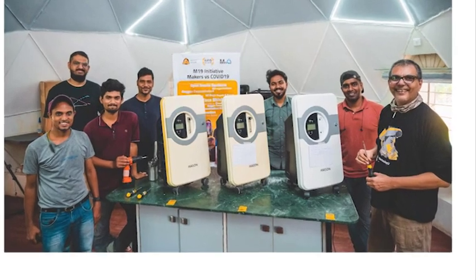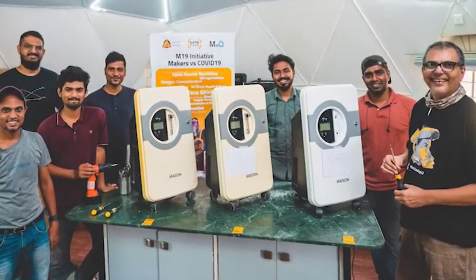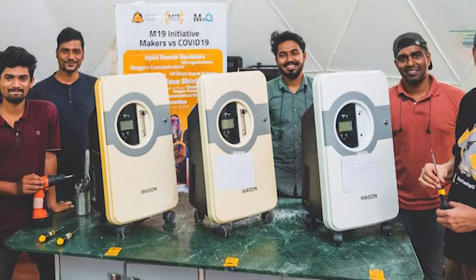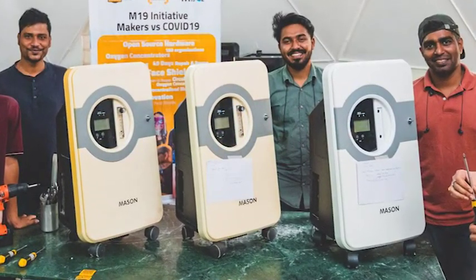One of the most interesting revelations during the initial research was that while on one hand we had a few thousand requests to repair oxygen concentrators that were donated in the second wave, on the other hand we also found out that a bunch of hospitals who got the donations had stocked them away and did not even know the status and condition of those donations.